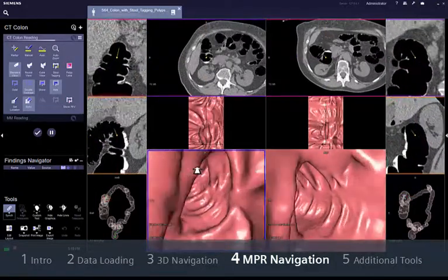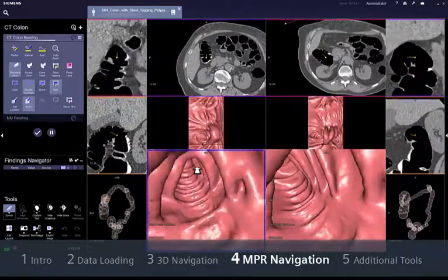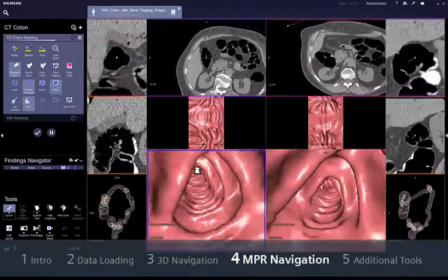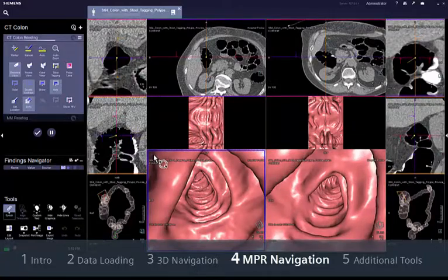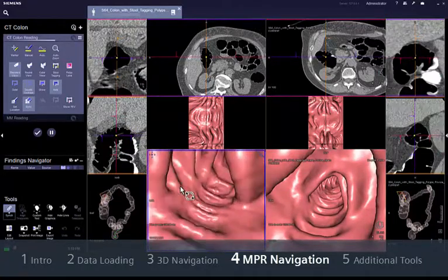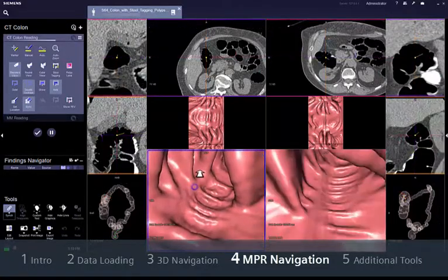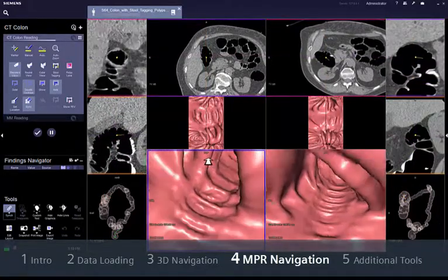The Turn Around function allows retrograde navigation once you have reached the caecum by antegrade navigation.